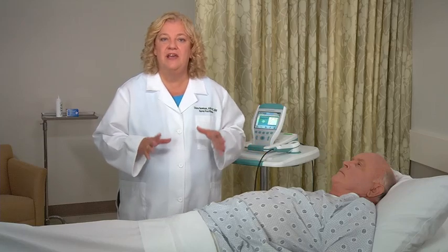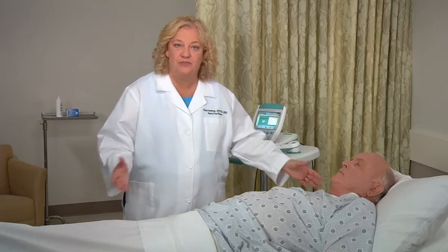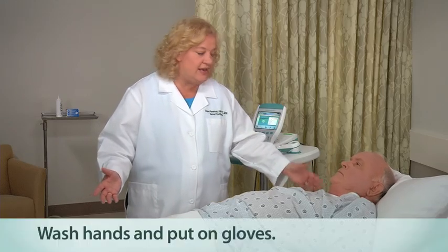If the patient is being scanned for post-void residual or PVR determination, it is important that the patient urinate before doing the test. Explain to the patient the bladder scan procedure and the reason for measuring bladder volume. Have the patient lie in the supine position, flat, with head elevated on a pillow.